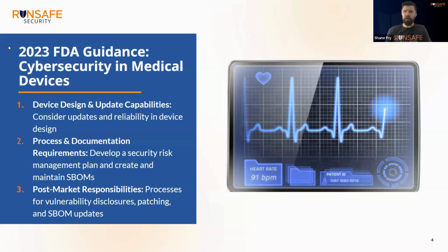And then you think about people that are responsible for deploying these devices. You may not have a good SBOM. So how do you build an SBOM and manage the vulnerabilities of the medical devices in your security perimeter? That's really tough, and that's where people look at binary-based SBOM solutions, and those are really limited in how accurate an SBOM they can get because they just have to guess at what's there, and some are better than others.